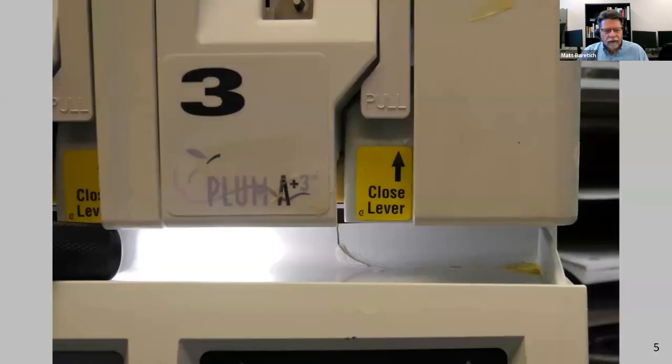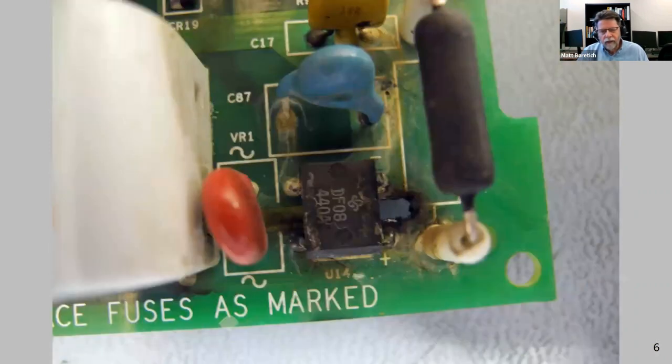And if we look closer, in both of these cases that I was involved in doing investigations on, there was a crack that occurred. There's some evidence of someone trying to repair it, but being unsuccessful. And when the fluid leaked onto this little shelf, it leaked down through this crack into the electronics down below and got down to this electronic component, which normally gets pretty hot. But the fluid started to burn and smoke started rolling out of this infusion pump.